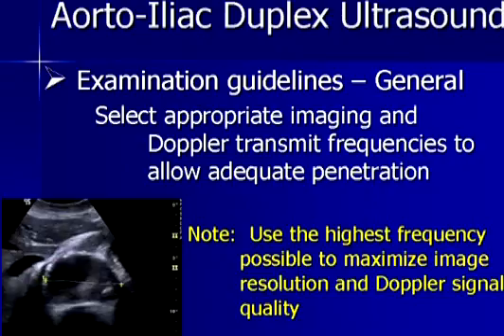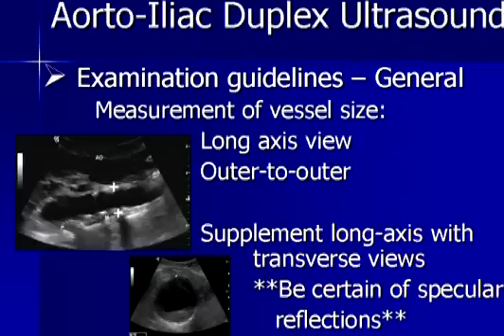And a good general rule to follow in ultrasound, both for imaging and Doppler, because it increases your signal strength, is to use the highest frequency possible for imaging and Doppler, subject to the penetration limitations that may be there, as this will enhance and improve your signal quality dramatically.